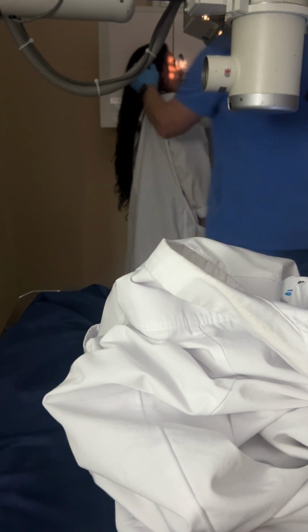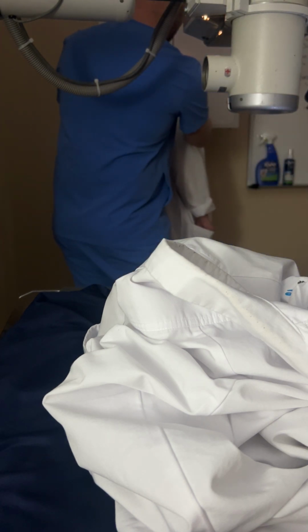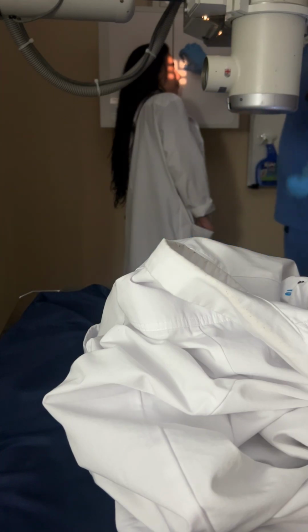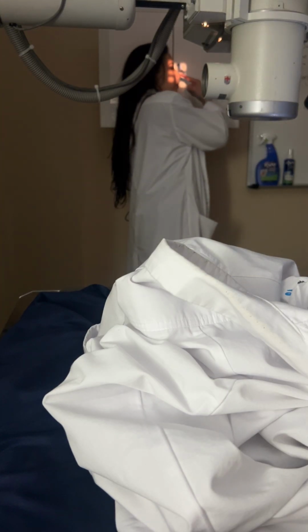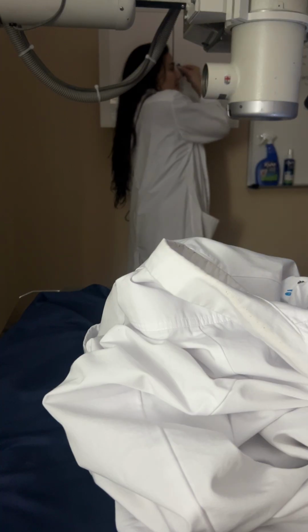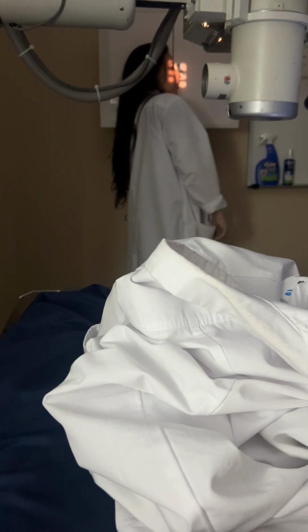And then based on our exam, it's going to do left and right lateral? Yes. So incredibly tight collimation on this. It's a very feather thin bone, okay? You do both the right and the left lateral for your positioning final, okay? This is the bone mostly. How would we be positioned on the tabletop though?